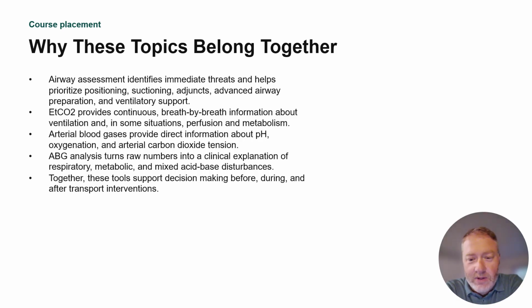Why do these topics belong together? Well, airway assessment tells us what the patient looks like right now, how they're breathing, how hard they're working to breathe, and whether they can protect their own airway. The end-tidal CO2 monitoring gives us continuous breath-by-breath information about ventilation and sometimes perfusion.